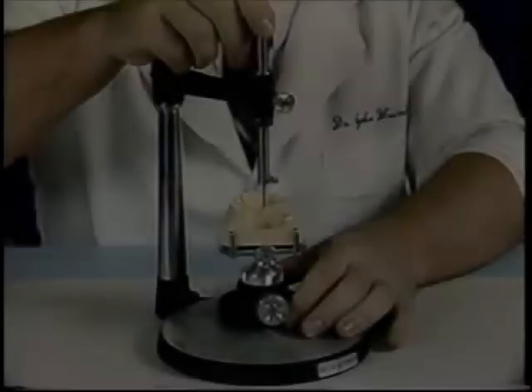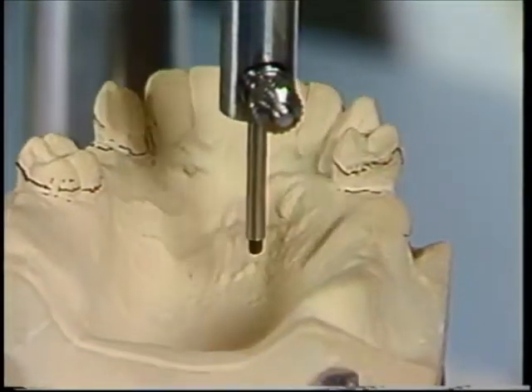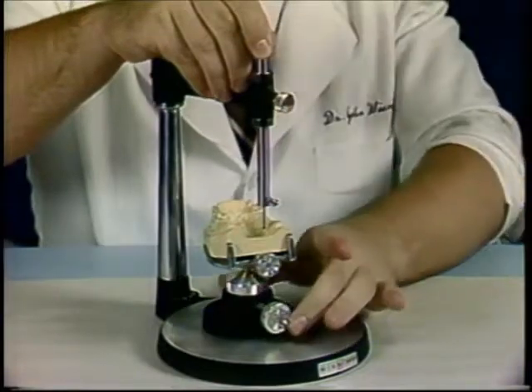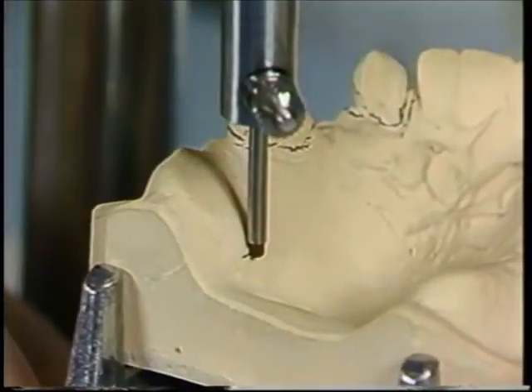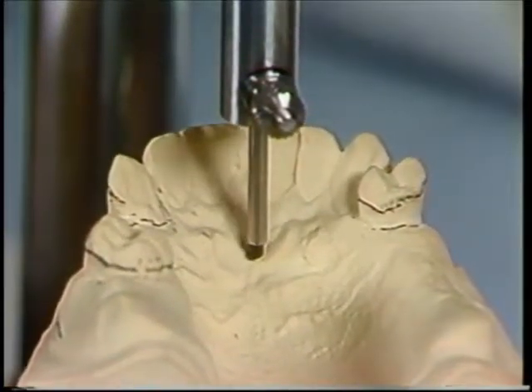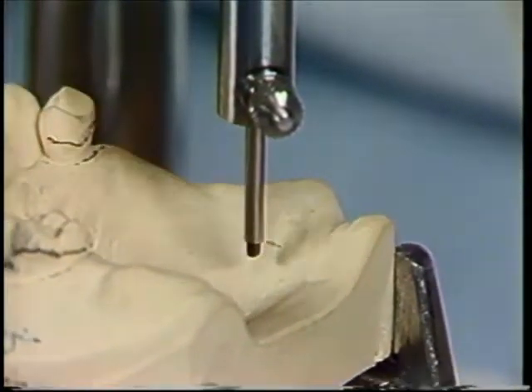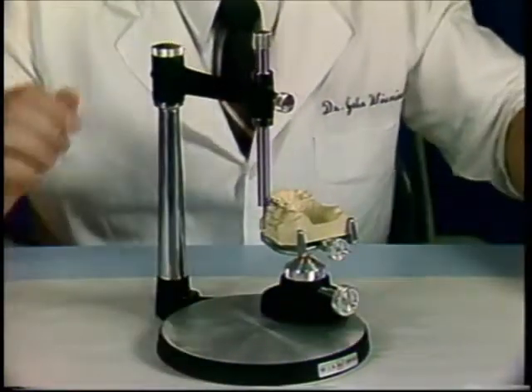Another method of tripoding requires the placement of 3 widely spaced dots on the cast. Using the carbon marker, 3 widely spaced dots are placed. In this procedure, the vertical spindle is locked. The marks are circled with red pencil to distinguish them from stray carbon markings.